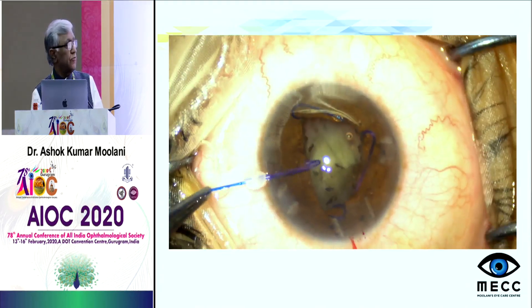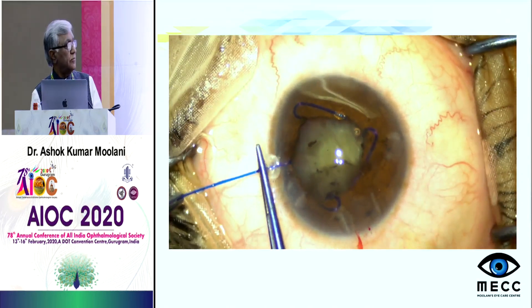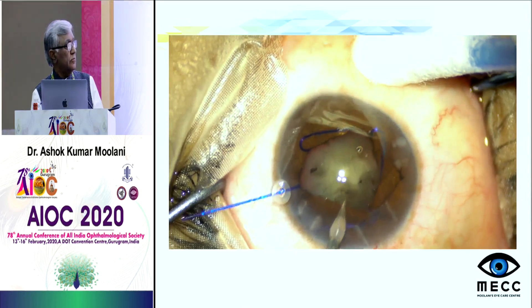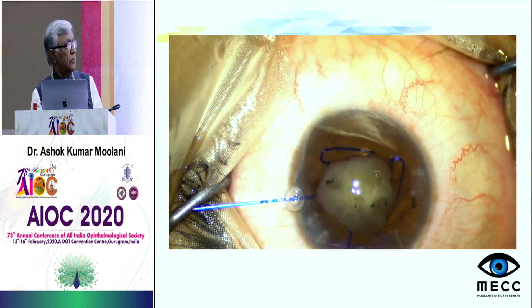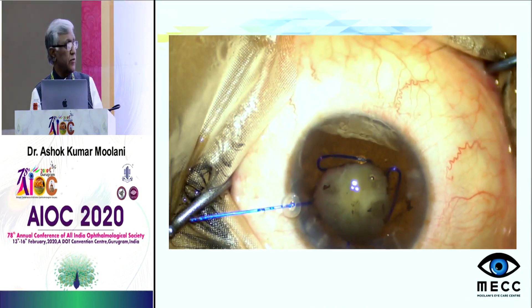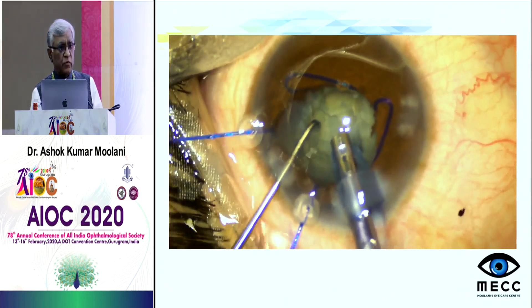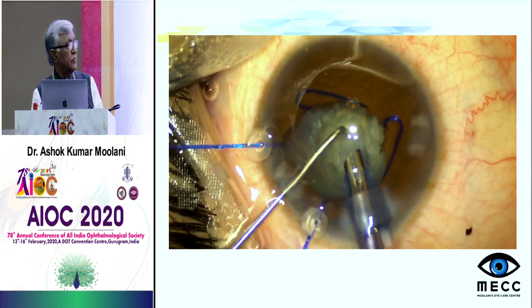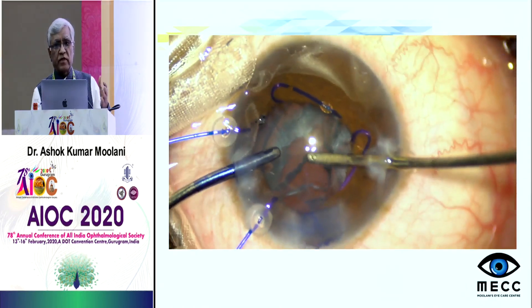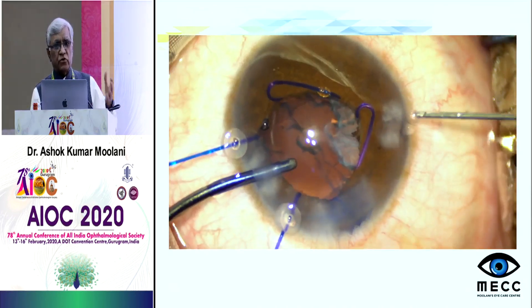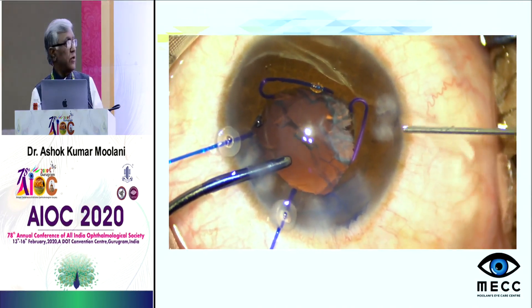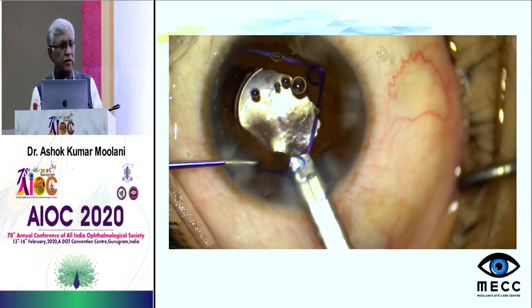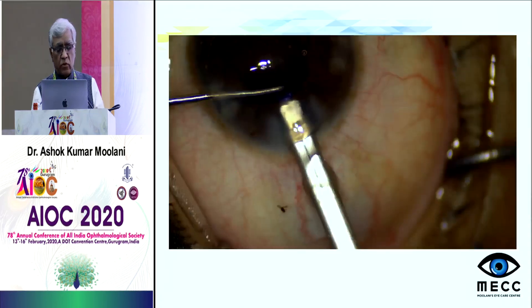When preparing the incision for iris hooks, don't over-pull the hooks, otherwise you will cause trauma to the pupillary margin. The purpose of showing this case was that it is quite unusual to use both devices together in one case — but the whole purpose is to perform an uneventful surgery, and this is how we completed it.